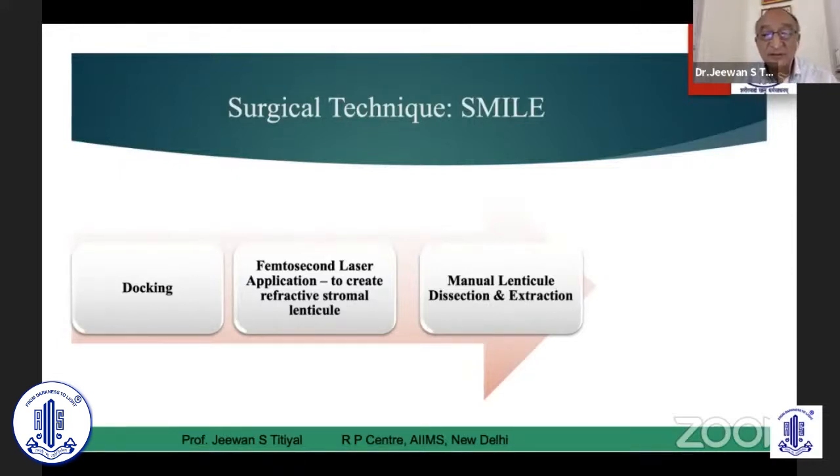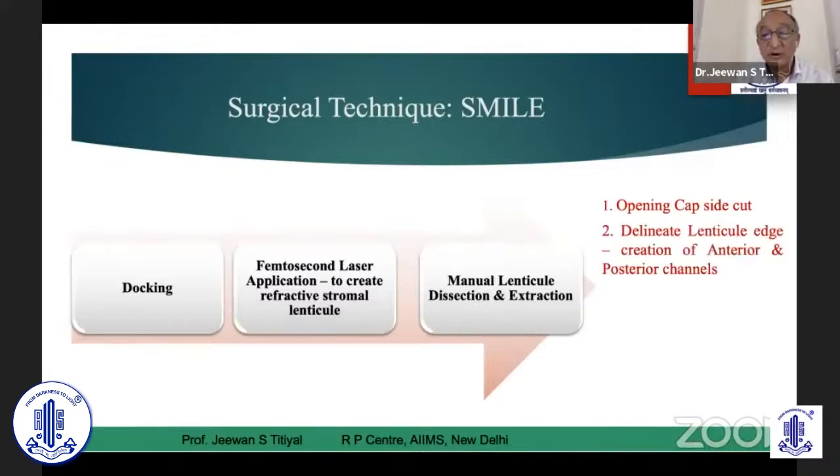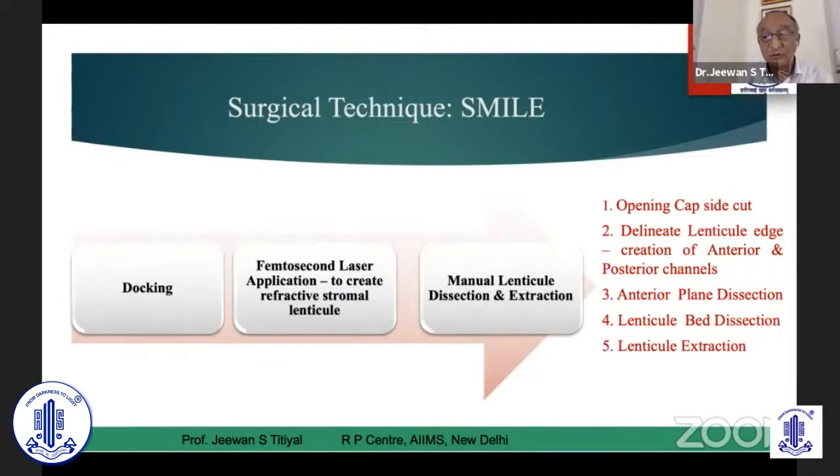There are five or six steps in lenticule extraction which are important. The first one is identifying then opening the cap side cut — this is one of the most important steps to assess how deep or how superficial you are to create the lenticule edge. That is by doing an anterior and posterior channel dissection that will create the lenticule edge for your subsequent dissection for the anterior plane, then subsequently going deeper for a lenticule bed dissection. These four important steps get you to a lenticule which could be extracted safely. After you extract, you need to inspect the lenticule for its completeness, especially in difficult cases.